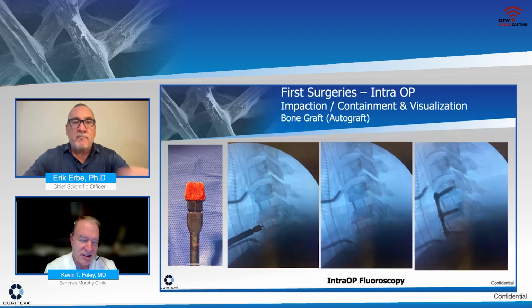What you see on that left side is the powdered autograft from my decompression press fit into that piece of porous PEEK. And if you flipped it over, the other side would look identical. There's a small central cavity in the current Inspire implant. Hard to see here because I've filled everything with bone, but you literally can take the material I use, that powdered autograft, and press it right through that piece of porous PEEK.